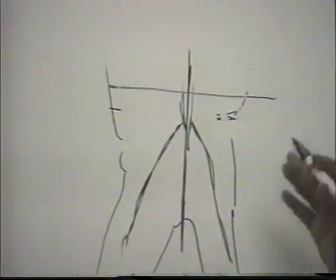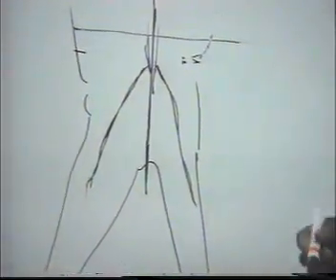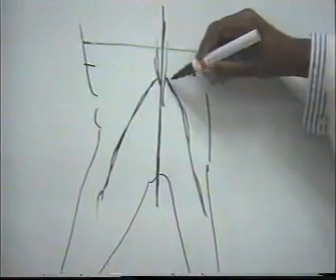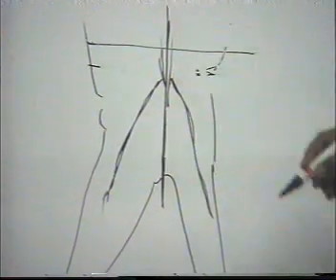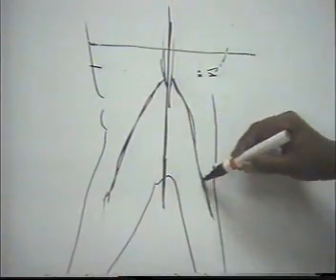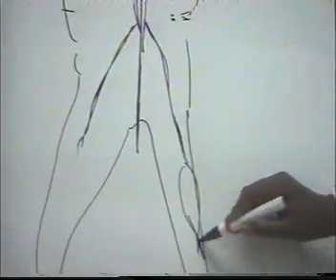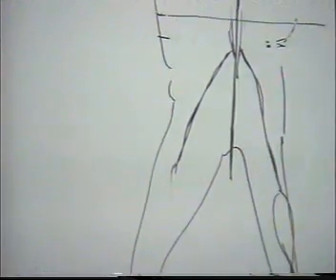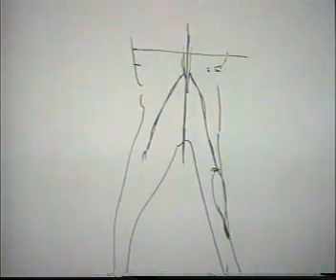We have two preparations. We keep one for later use in a Ringer solution, and then we follow the sciatic nerve, clear the sciatic nerve. We do blunt dissection until it reaches the gastrocnemius muscle. You have to do the dissection carefully, because if the nerve is damaged, the conduction will be impaired.